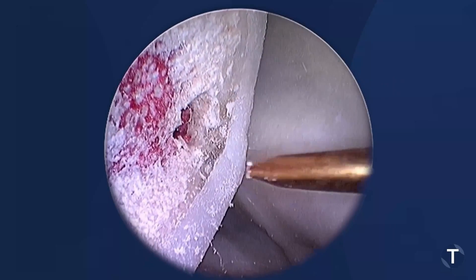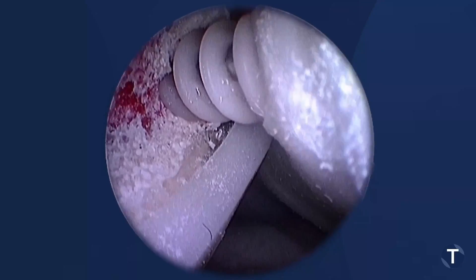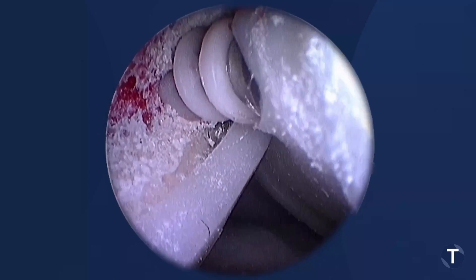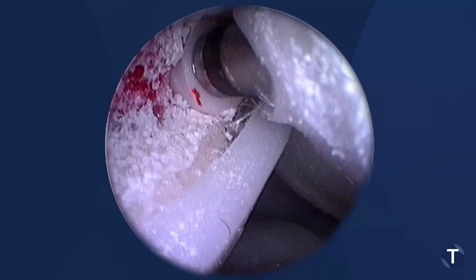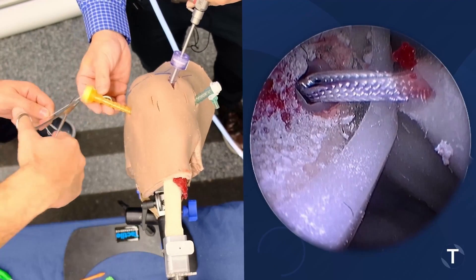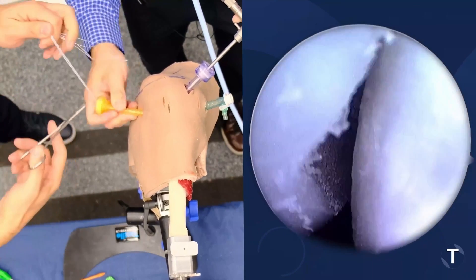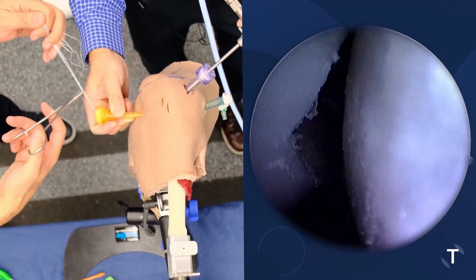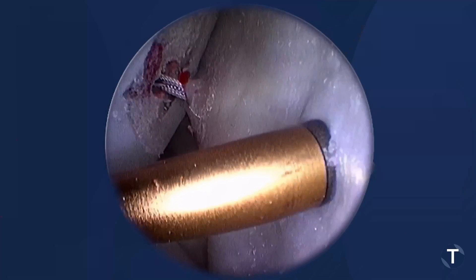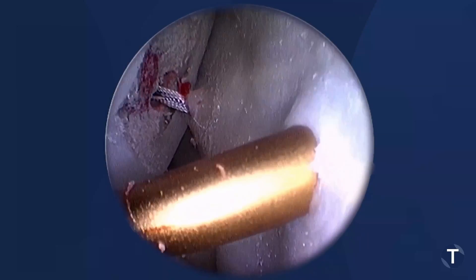We're going to take an anchor and twist it in. We're just going to snap those to the side and then put our superior anchor in. We're going to use that cannula to make sure we're extra-articular again. See how we've created that bridge between the superior and the inferior anchors.